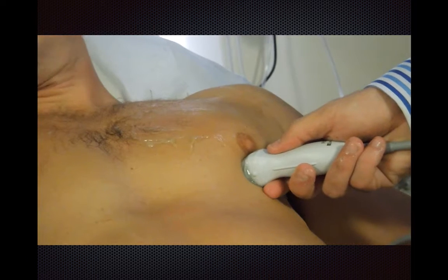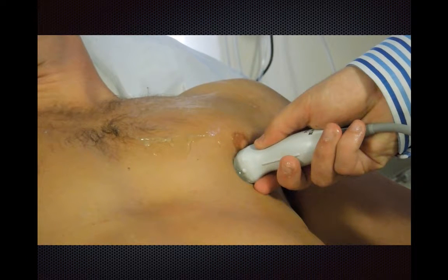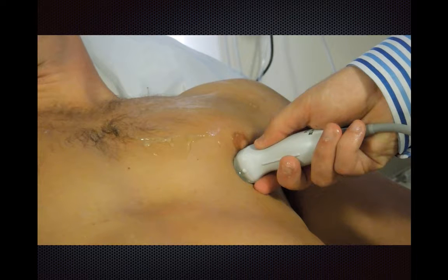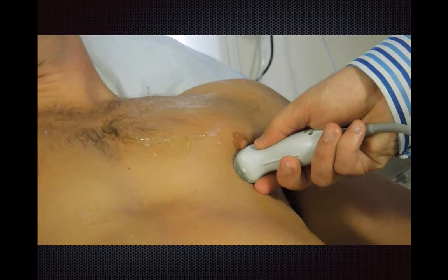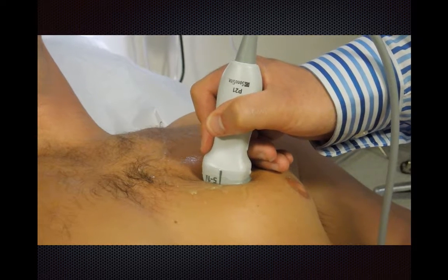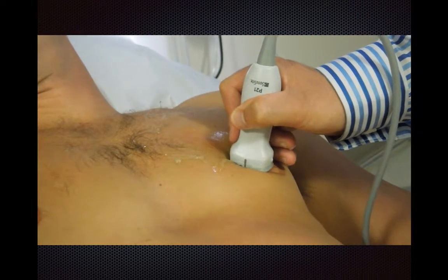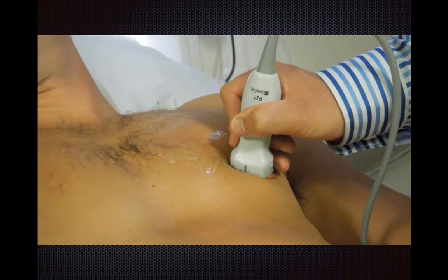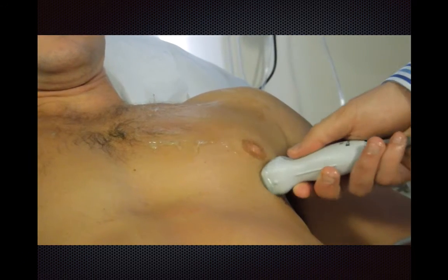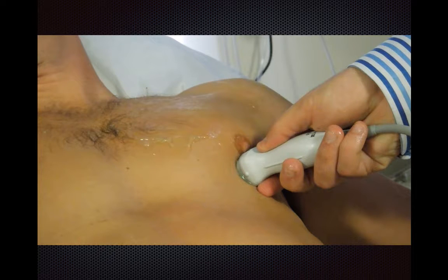One way to obtain this view is to look for where you think the apex is and then obtain a coronal section of the apex. An alternative approach is to start out with the parasternal long axis, directly visualize where the apex is, and then obtain a coronal view that way. Both approaches are reasonable.